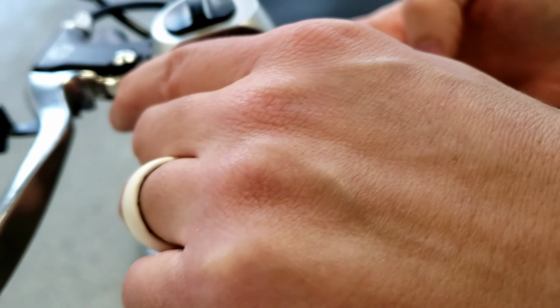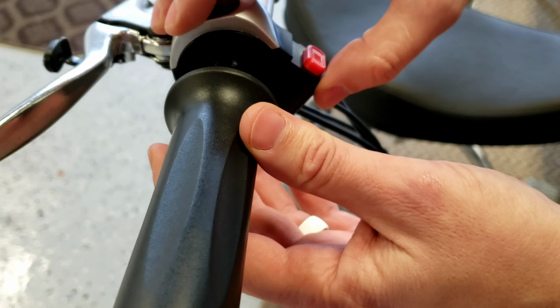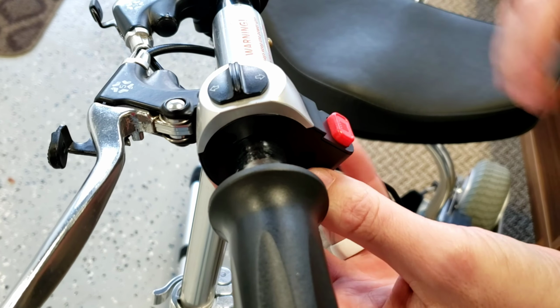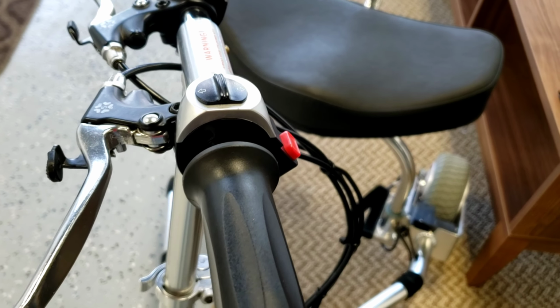And what I like to do is I like to test it to see if that fixed the issue. If it didn't, then you didn't cut off enough. Just go back in, remove this, and cut off the remaining parts that are sticking out. And then you do everything in reverse. We're going to put these back on.